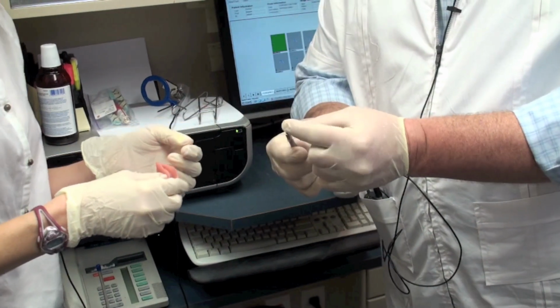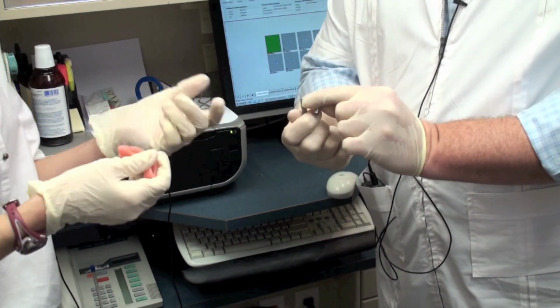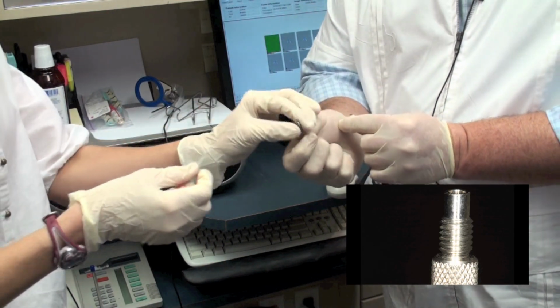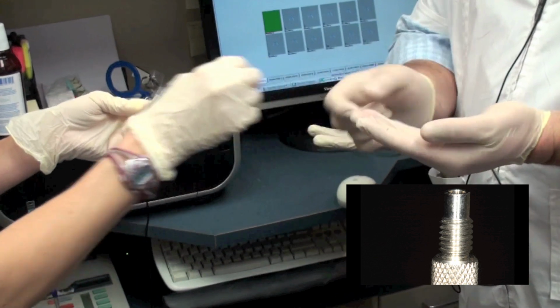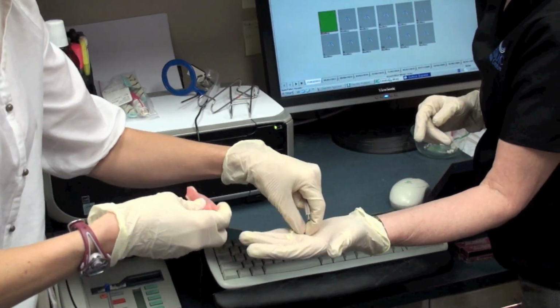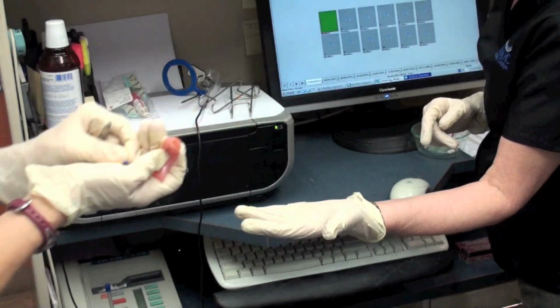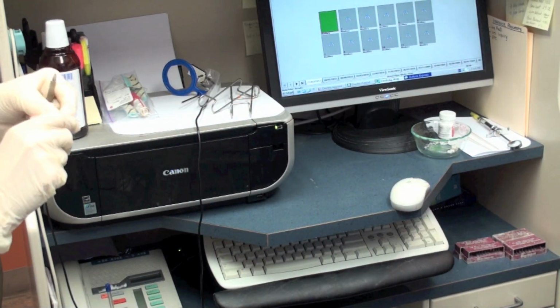What you don't want to do is use this to put it in. You want to make sure it's the part that's smooth, the underneath inside part. Is it because you warp it? Well, you damage it. So that piece just goes, so you just kind of dispose of it, just because it's larger than the actual size. So once we get this done, we're going to try it back in the mouth and just see how it fits over the locators like they are.